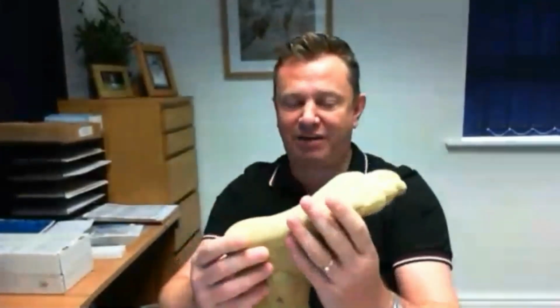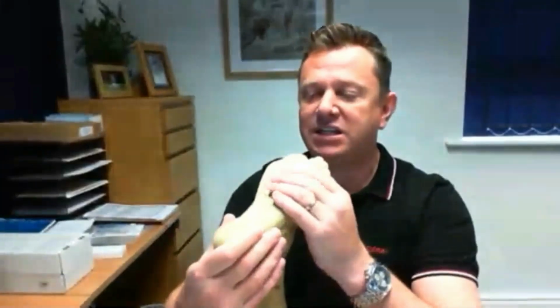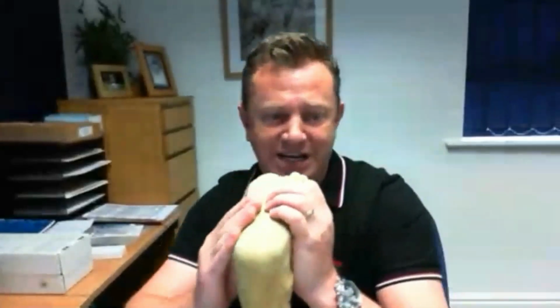So our scanning platforms, if we're going to do them and we've got deformity, they need to be able to have medial and lateral wedges to be able to stabilize those, and things to help us have really high arch profiles if they're necessary, or for feet that supinate, something that allows the arch to drop, because who wants a high arch on a supinating foot?